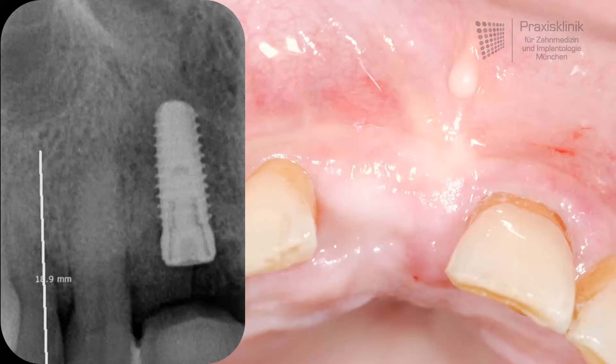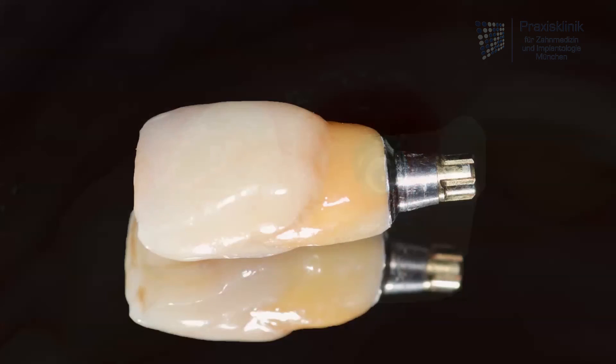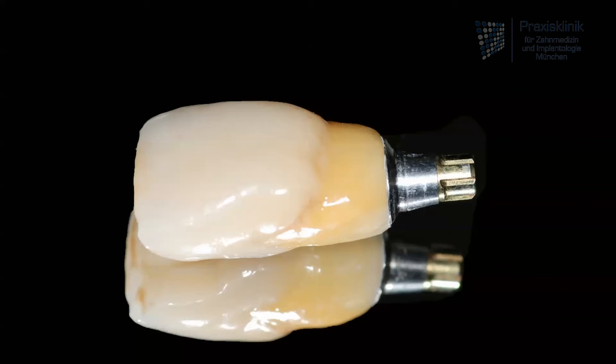Now we have to wait for another three months, and after that the implant can be uncovered. In the next step the soft tissue around the implant has to be formed. Normally we do this by having a fixed temporary crown which is screwed into the implant. For the patient this is very comfortable because he has a fixed temporary solution until the definite restoration is fabricated.